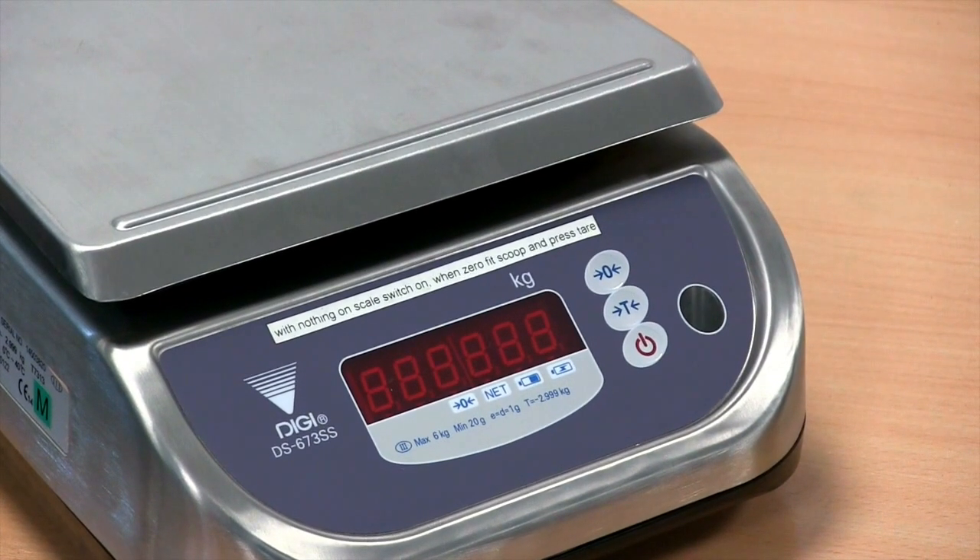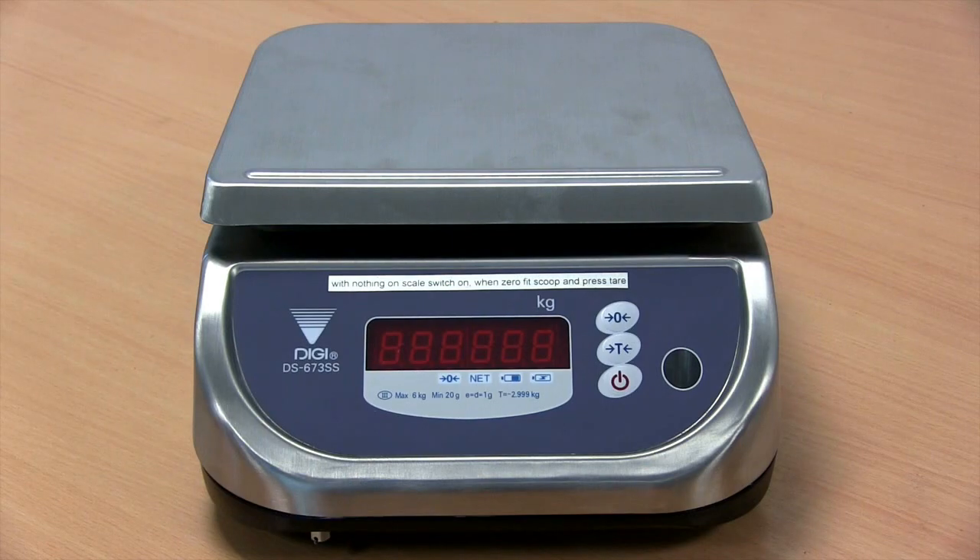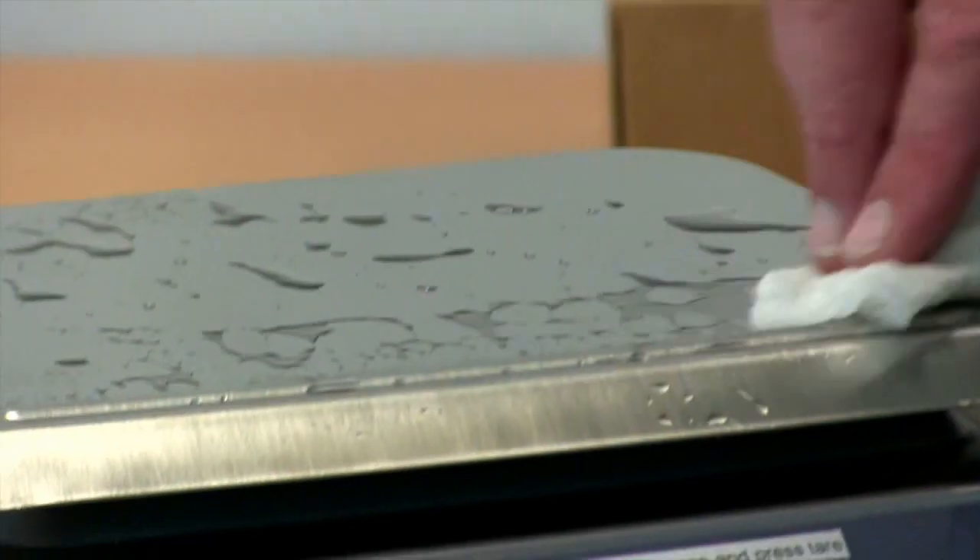Hi, I'm Des McCullough. I'm here at the Marsden factory in Rotherham to show you the DIGI DS673SS. The DS673SS is Class 3 approved. It's a popular solution for weighing swabs, organs, urine or nappies because its IP68 rating means it's waterproof.